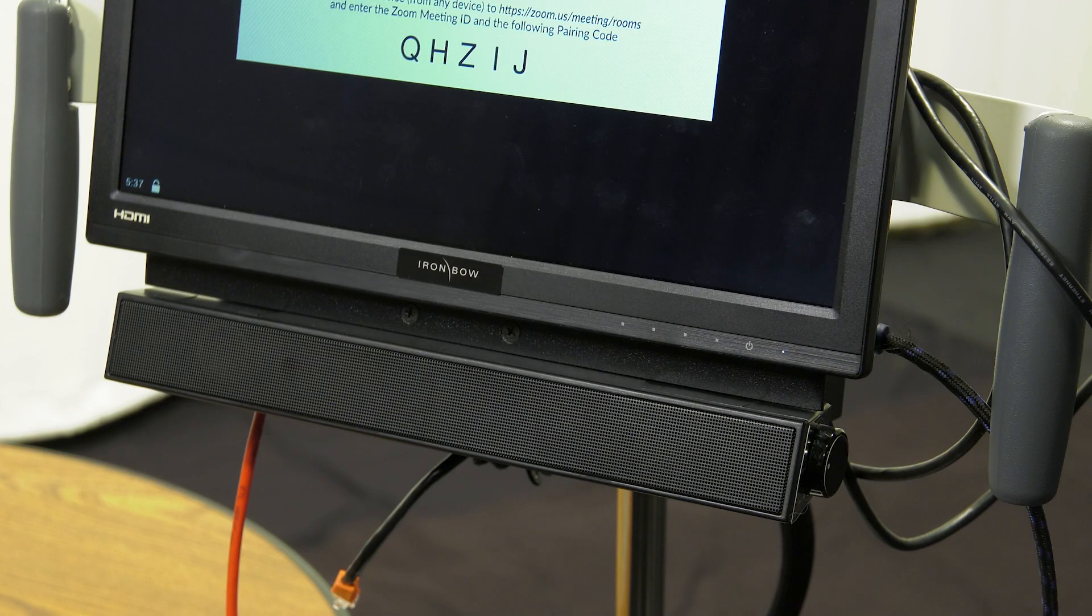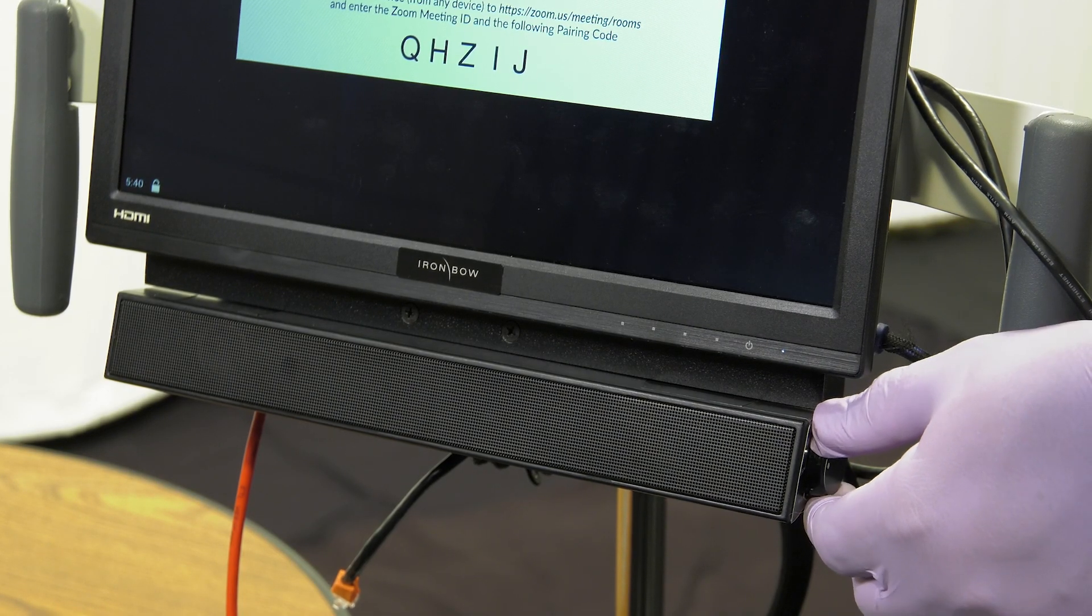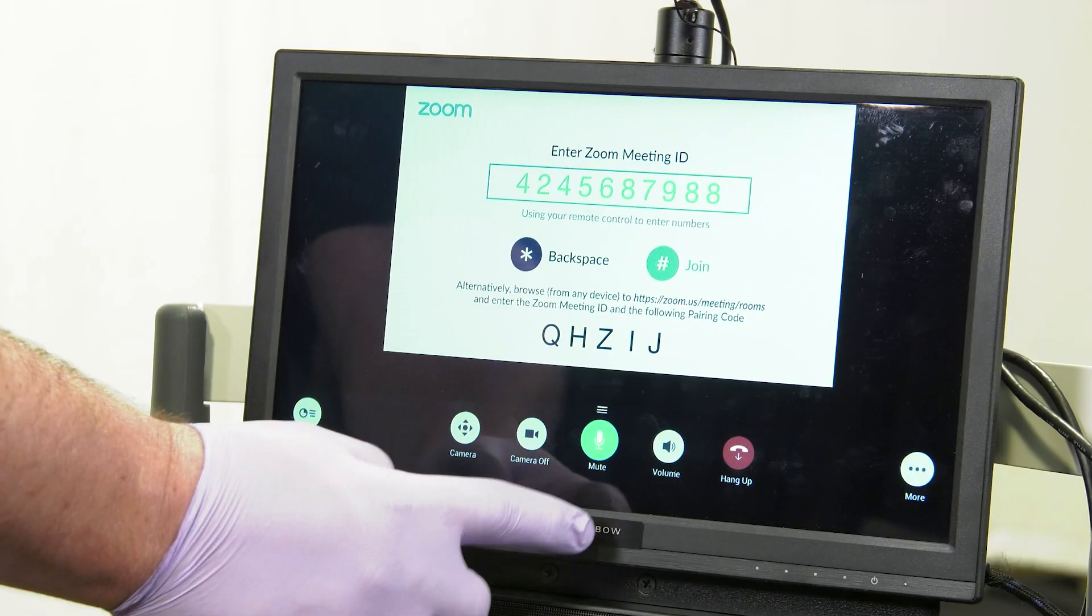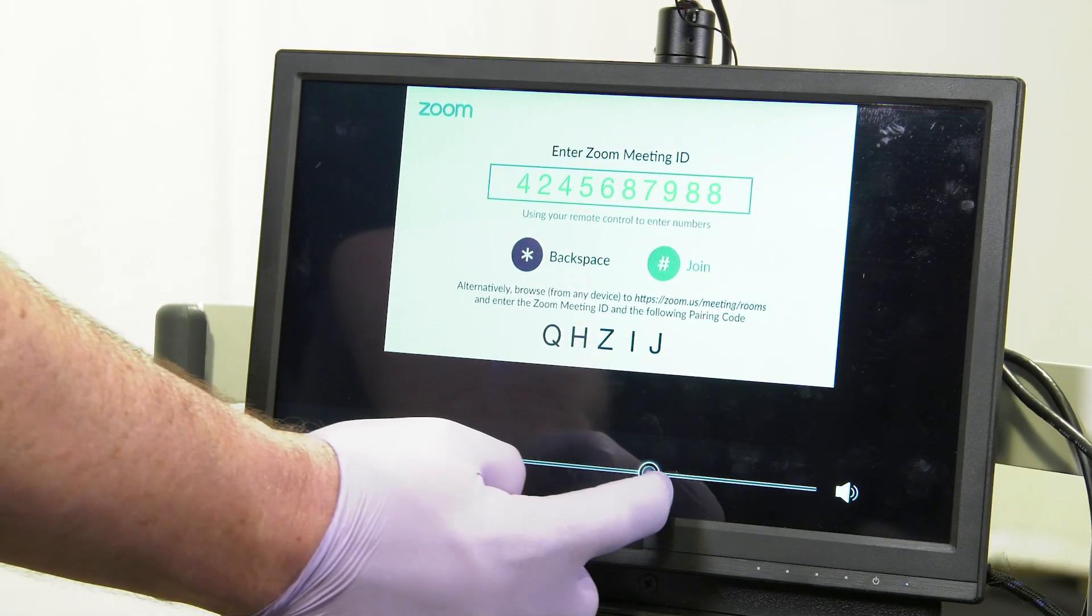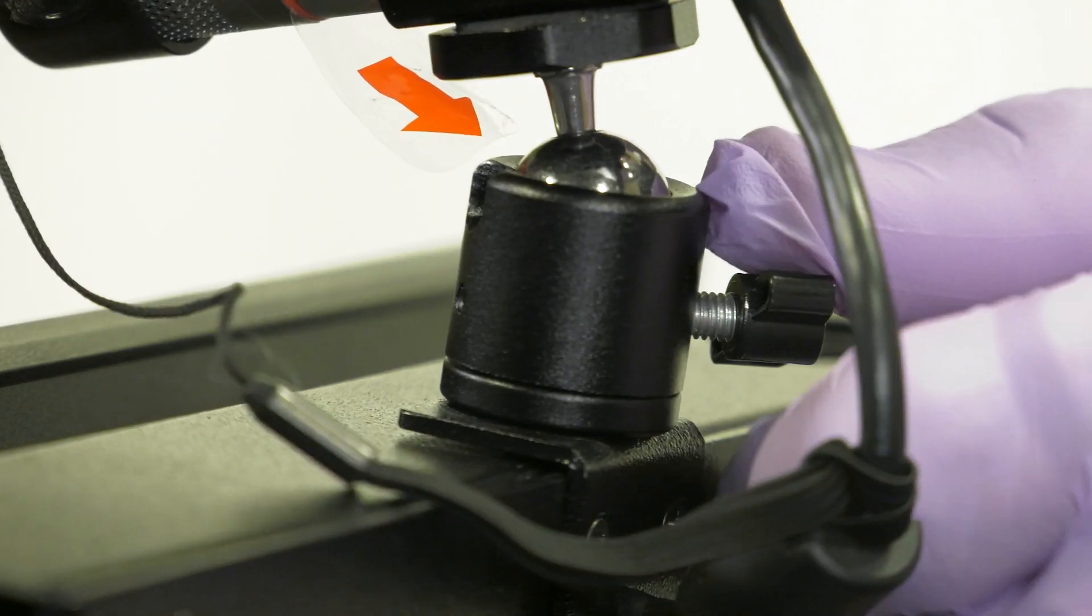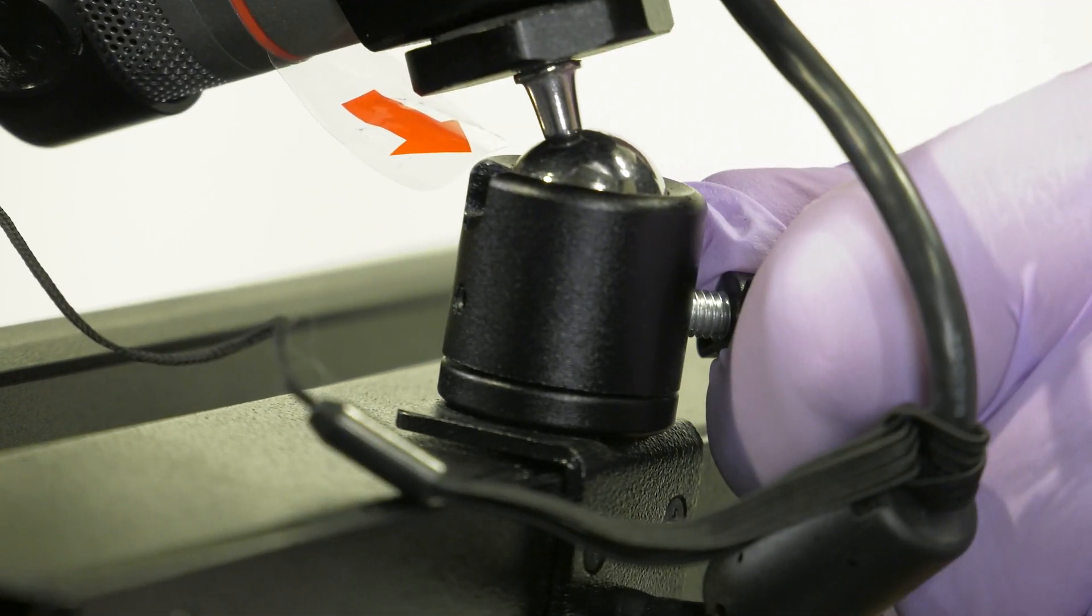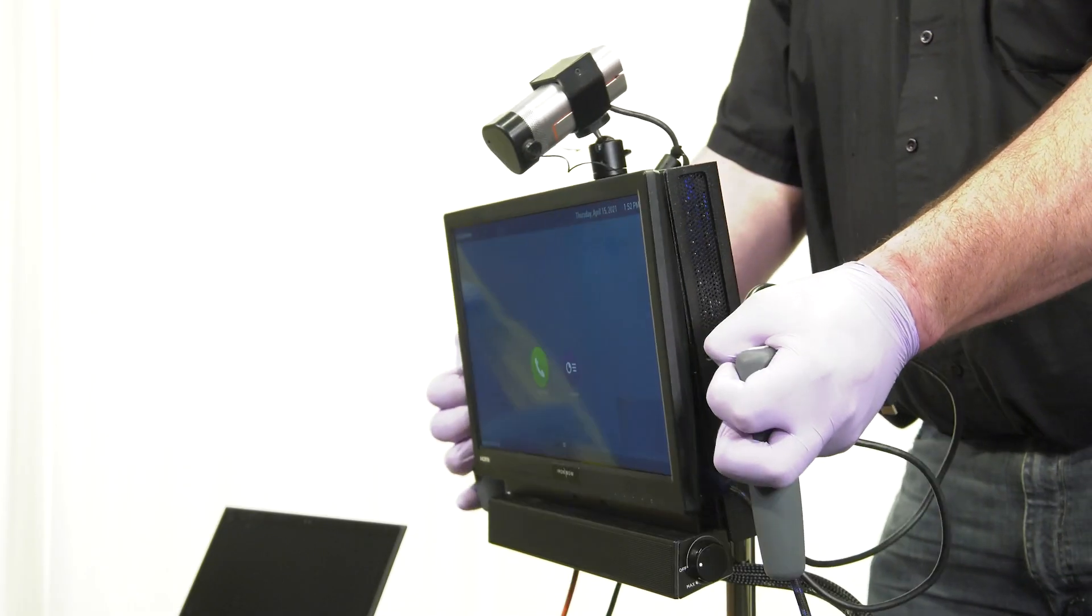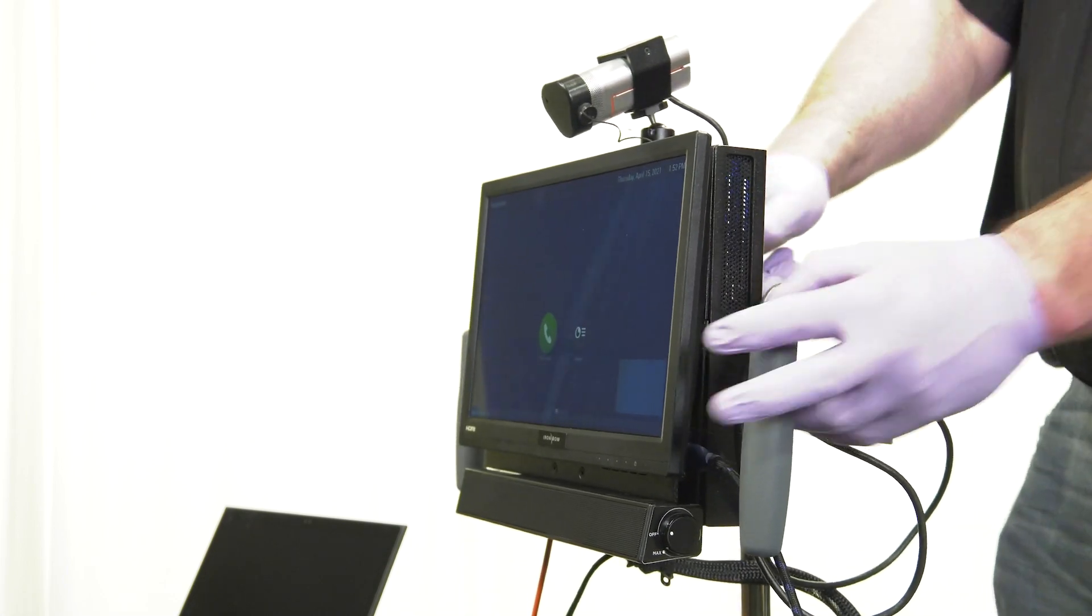To adjust the volume of the cart, use the dial on the side of the attached speaker. To adjust the volume of the cart's microphone, use the on-screen volume buttons. You can adjust the angle of the camera by twisting the base and positioning it to your preference. The screen is also adjustable by using the handles and knobs around the sides of the screen.